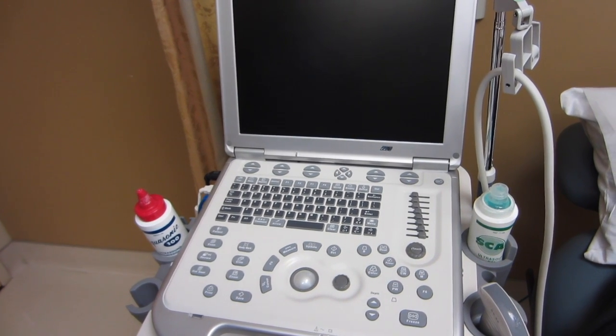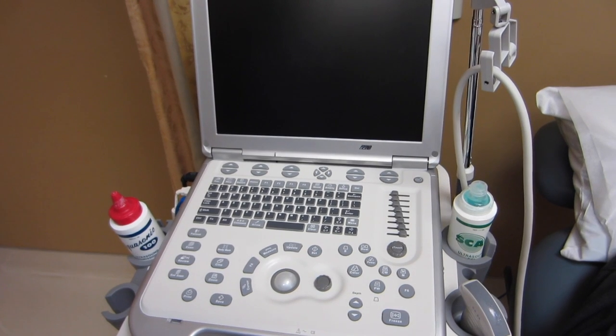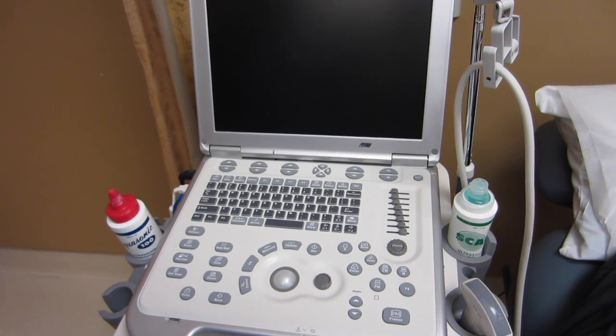This is an instructional video on how to measure the abdominal aorta. The goal of this exam is to visualize the entire aorta from the diaphragm to the bifurcation located approximately at the level of the umbilicus.